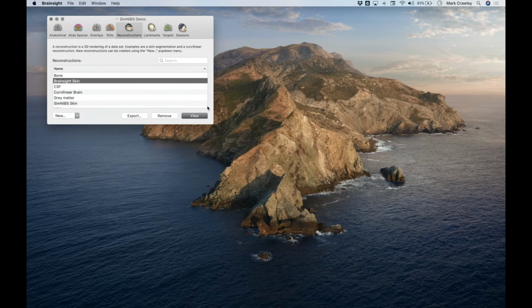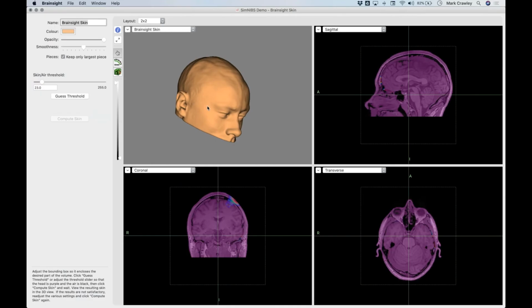We do, but it might be good to show this in action as well, in addition to answering it right now. Okay. It's regarding optimizing the orientation of the coil using the optimize button, the one you mentioned earlier. Okay, cool. Yeah, we'll take a look at that.